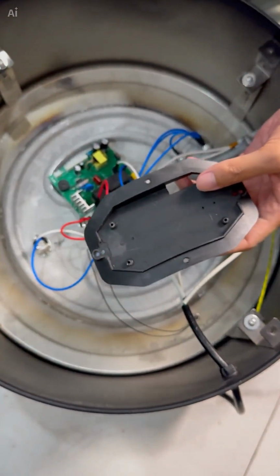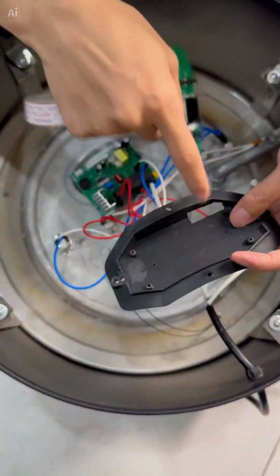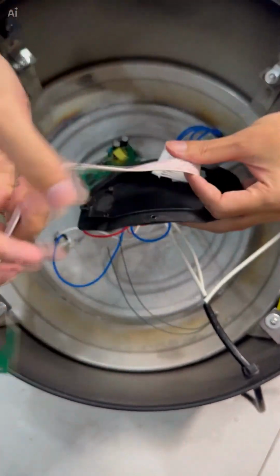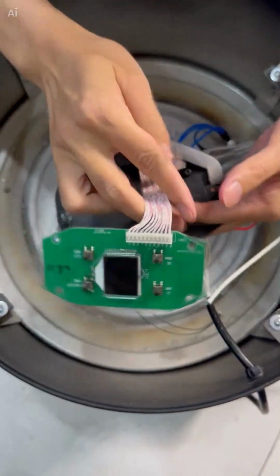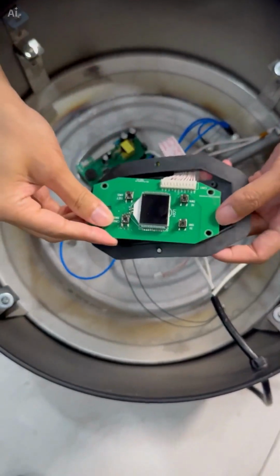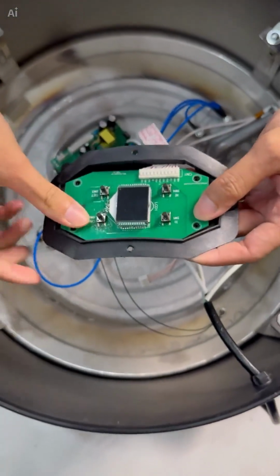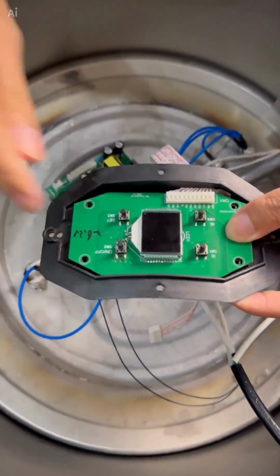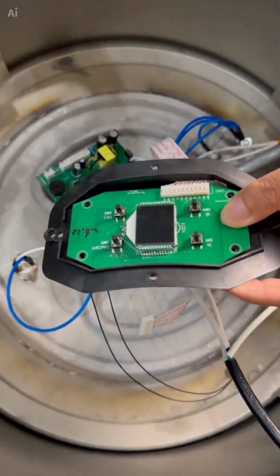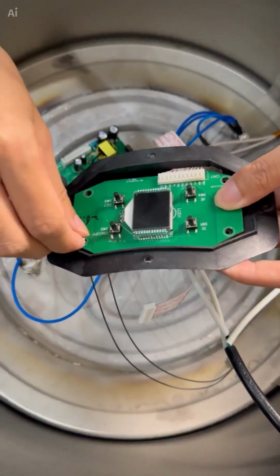Then now we are at this notch direction and the ribbon cable is installed from this plate. Okay, this is the new display board. Then install it, align the 4 holes, and then screw in the 4 screws that were just removed one by one.